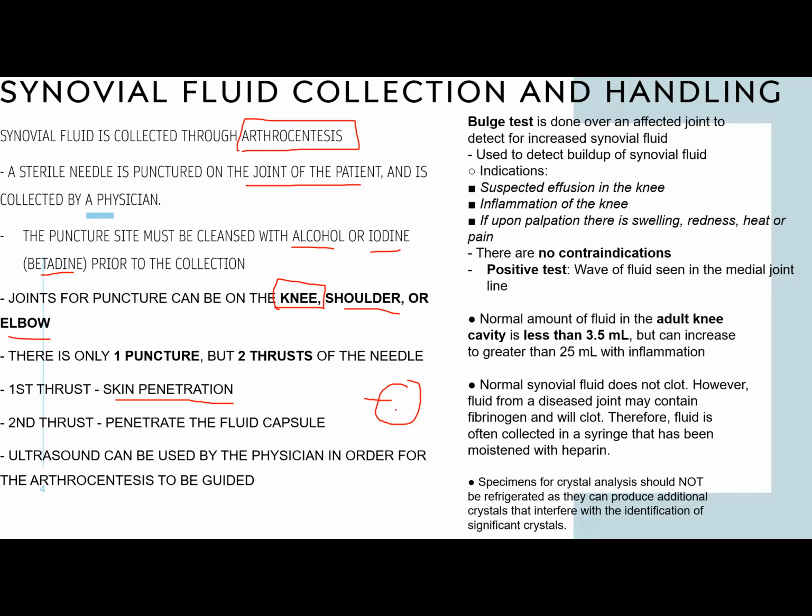Now, after that nakapasok na siya, the doctor would again penetrate it for the second time so that the needle could enter the fluid capsule or yung cavity, yung synovial cavity. Then from there, i-aspirate niya na yung sample.